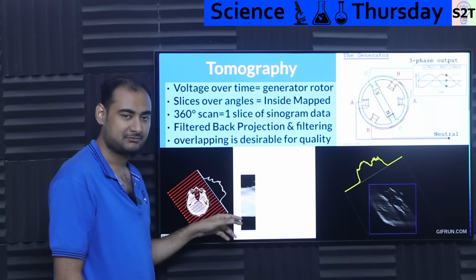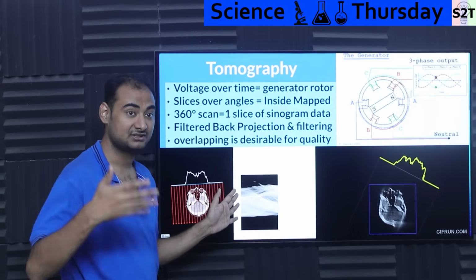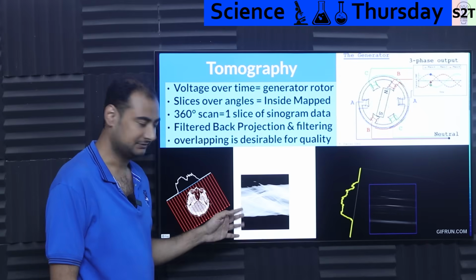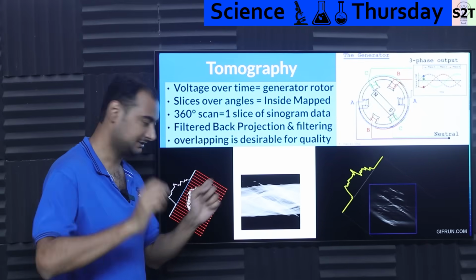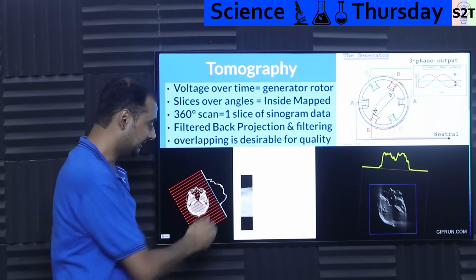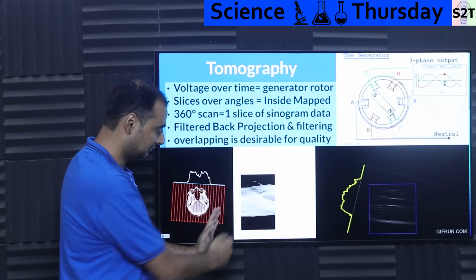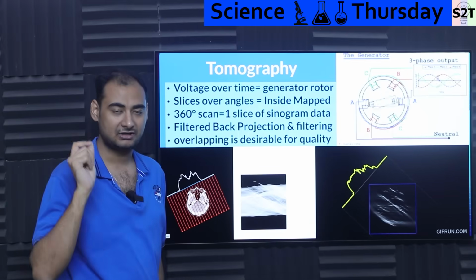So your black parts are super bright, where the X-ray just hit it, and the white parts are not, where the X-ray was attenuated. So you have a reduction. And then that's your one slice, basically the width of the sensor. Tada, that's one point. And this is moving along as you are rotating around. So you're getting a sinusoid.